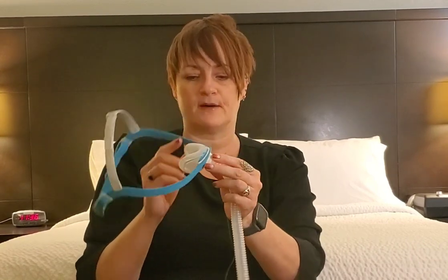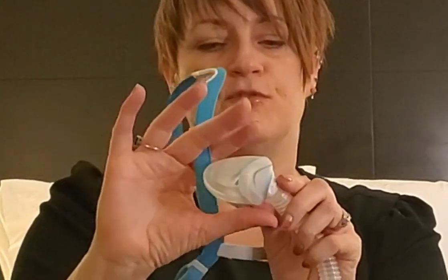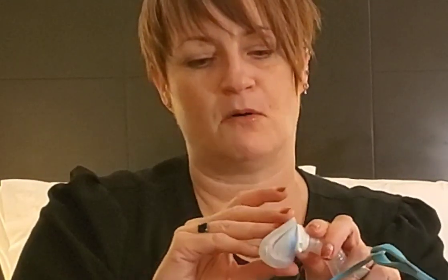So the whole thing comes apart. You can pop your headgear off really easy. This is supposed to be washed every week. And then you rock your nose piece here from bottom to top. It just pops right off. You wash this piece every day. You throw them away every couple of weeks and put a new one on there as it wears out.